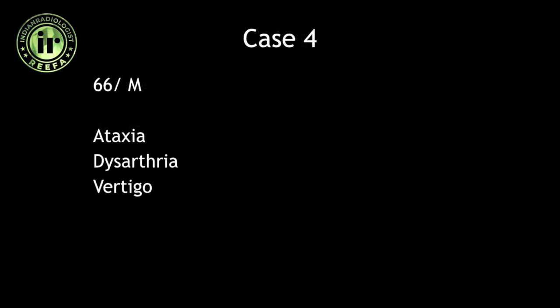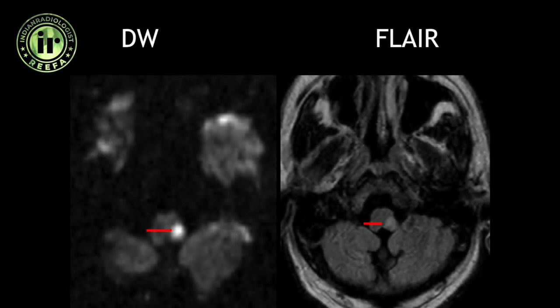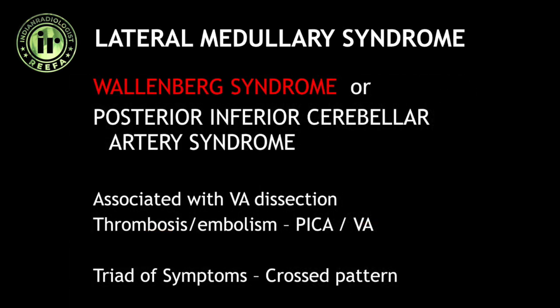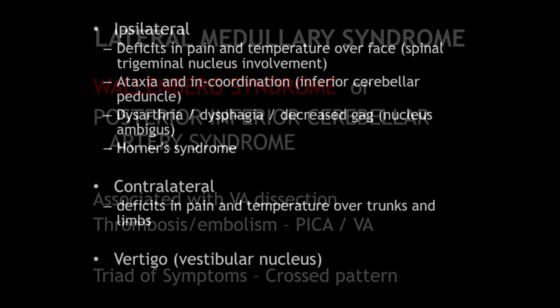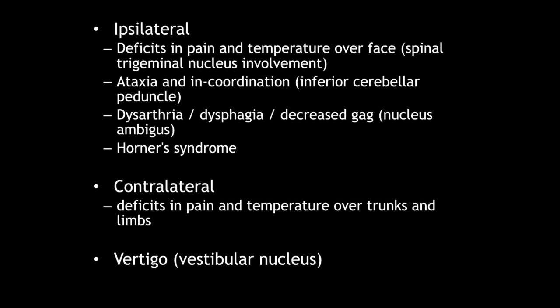A 66-year-old male came with ataxia, dysarthria, and vertigo. MRI of the brain showed restricted diffusion within the left medulla, posteriorly and laterally, appearing hyper-intense on FLAIR images. This is a case of lateral medullary syndrome, also called Wallenberg syndrome or posterior inferior cerebellar artery syndrome. It can be associated with vertebral artery dissection or thrombosis or embolism of the PICA or vertebral artery. It has a classical triad with a crossed pattern — ipsilateral and contralateral findings combined with symptoms from vestibular nucleus involvement. Restricted diffusion in the lateral medulla confirms this diagnosis.